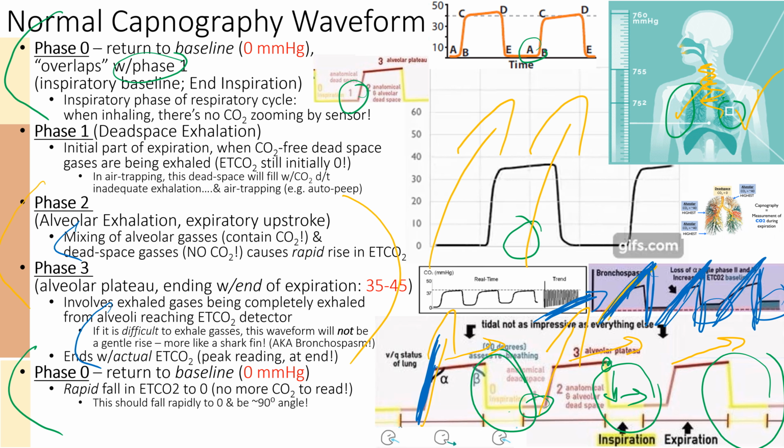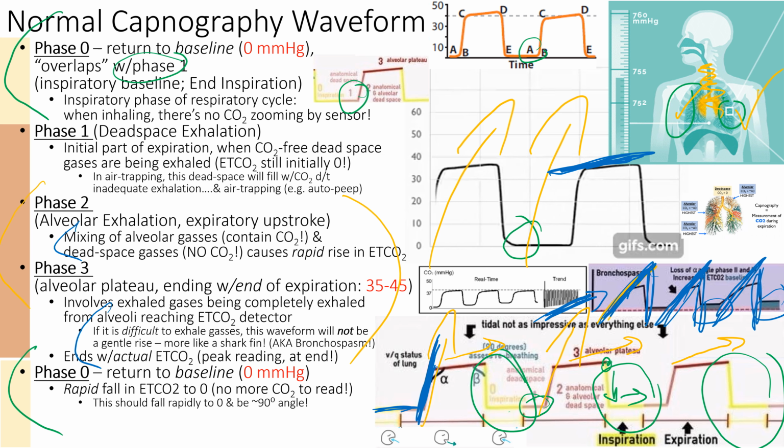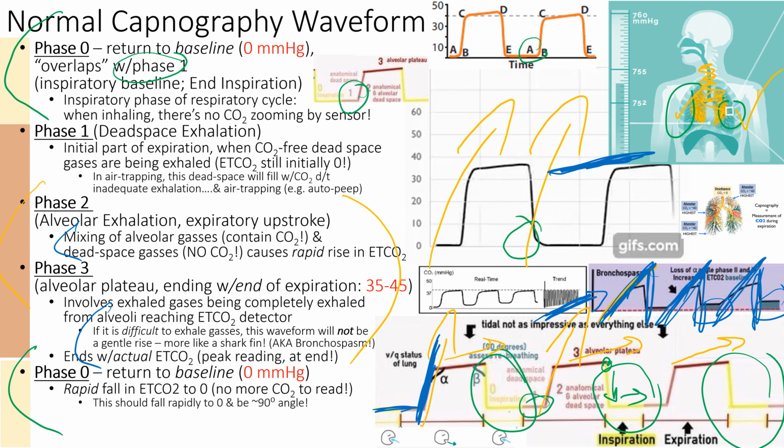Okay. So we want to see a slightly flat top. On the bottom, you want it flat. On the top, you want to see a little plateau. You want to see a plateau that's kind of upright a little bit. Okay. The little analogy is if that was a top hat, you want a teacup to sit on top because you are fancy. Okay.